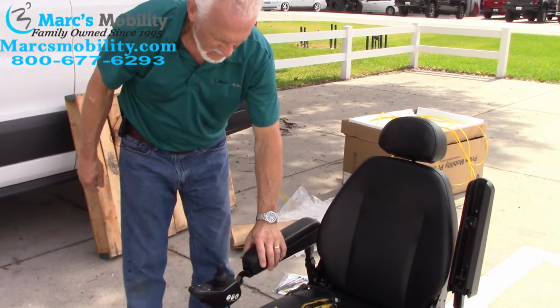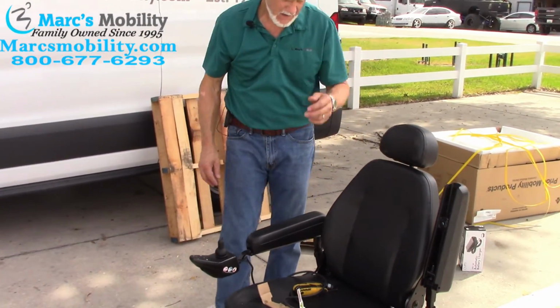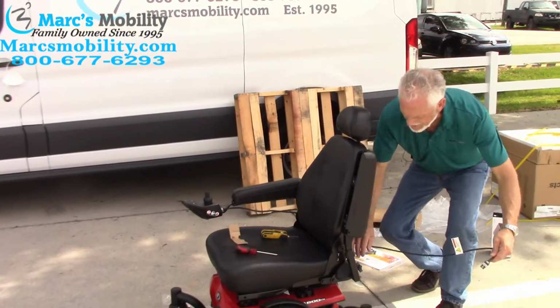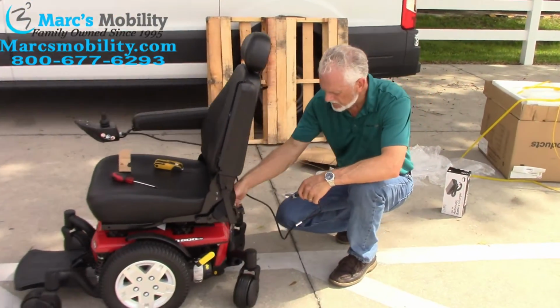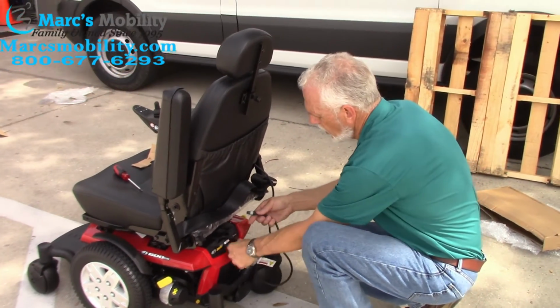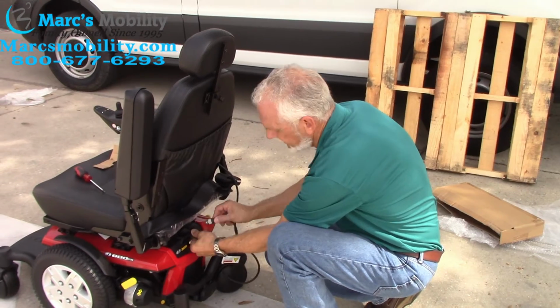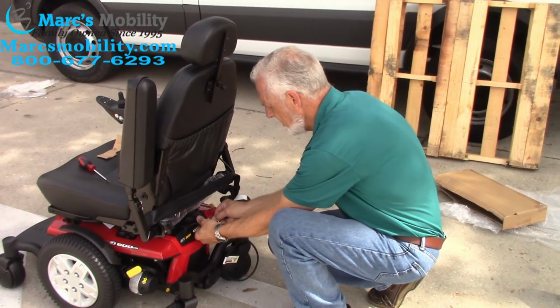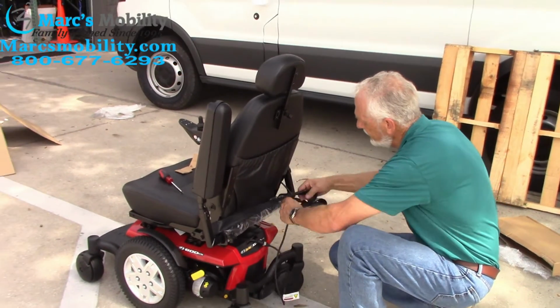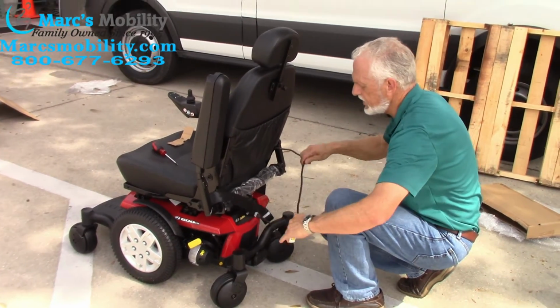Now, the joystick is on your chair. You're gonna take your cable, you're gonna run it to the back, right here. Right here's your plug. You're gonna unplug it. There's only one way it can go. If it doesn't go in, don't do it. Then you'll tie your cable.